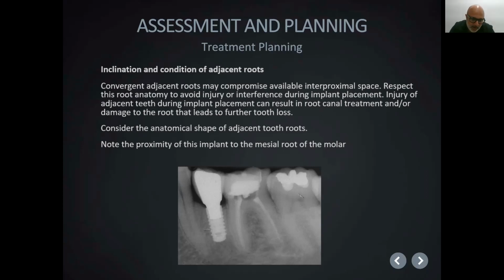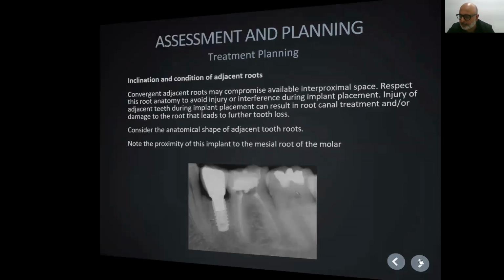As you can see, there's probably about a good 3 mil on the mesial. It's the curve of the root, so you can see how it curves out that mesial root. And at the top, you've probably got that 1.5 millimeters, but as you get further down and that mesiolingual and mesiobuccal root bulges forward, you've got less than that. You need to be aware of that.